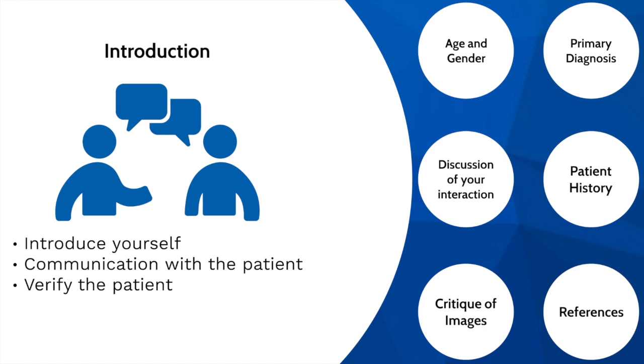Once you call your patient and greet them, you will introduce yourself by telling them your name and letting them know that you will be taking their x-rays. You will communicate with the patient by asking about their reason of visit and if they have any pain in order to not cause any more pain or make them uncomfortable. To verify the patient, you will ask them their date of birth and full name in order to confirm you have the right patient. For example, good morning, John. My name is Jesus and I will be taking your x-rays. Just to confirm, you're here just for a chest x-ray, right? Okay. Are you in any pain? Can I have your date of birth and full name, please?